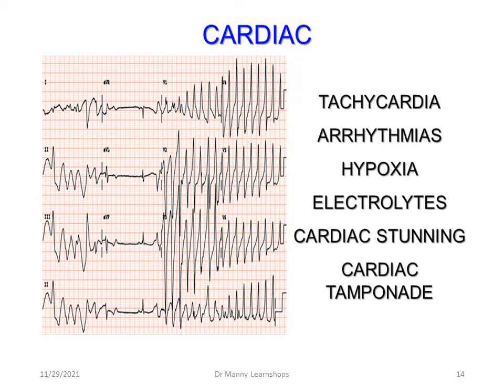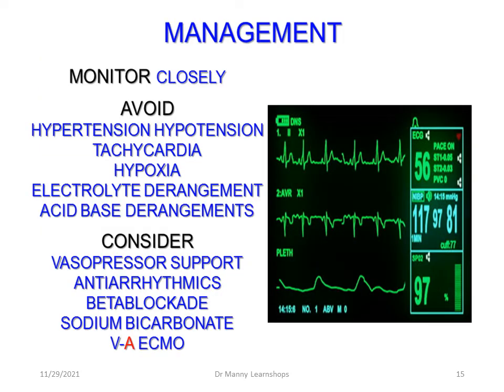Cardiac potential complications could be tachycardia, cardiac dysrhythmias, cardiac arrhythmias, bradycardia, hypoxemia, electrolyte imbalances, cardiac stunning, and cardiac tamponade. Management: monitor closely. Avoid hypotension and hypertension.